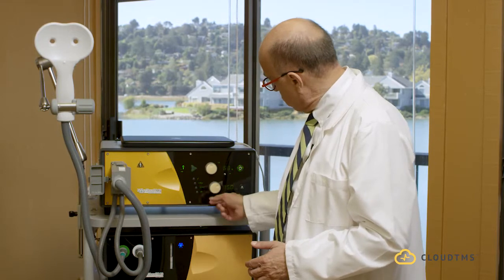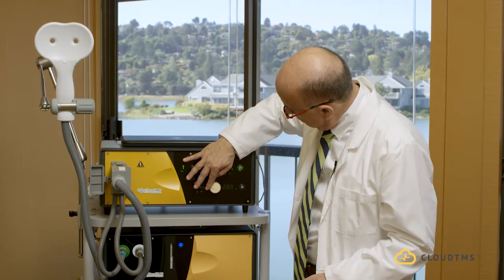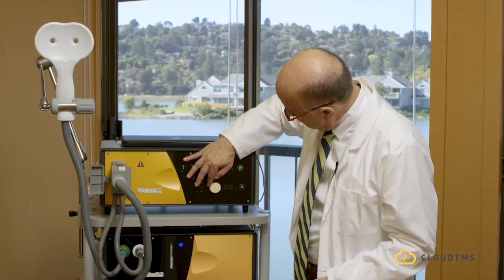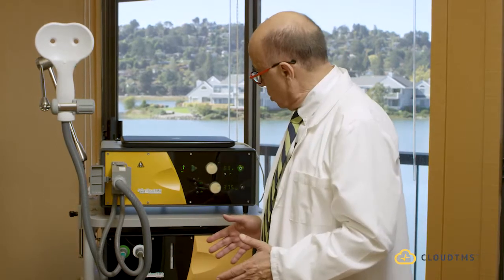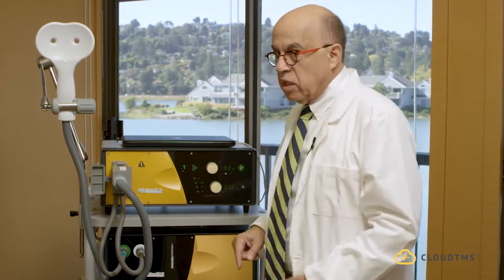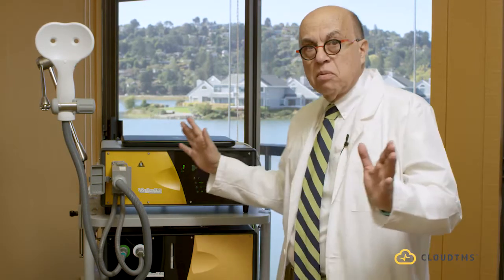That's the FDA-approved protocol. Here it shows 15, but I'm going to set it up to 37.5 minutes. Now, whenever I press this button, the machine will start stimulating. That's it — that's all you need to do to set it up.